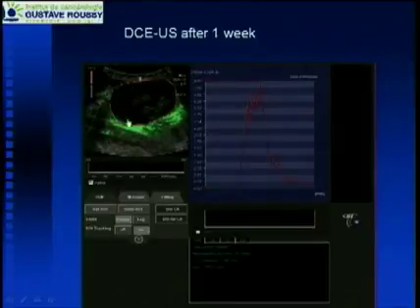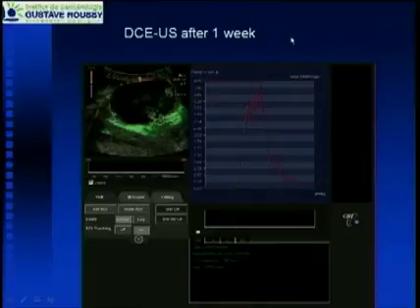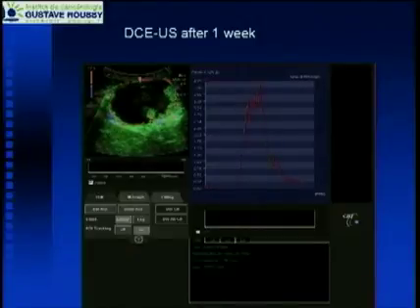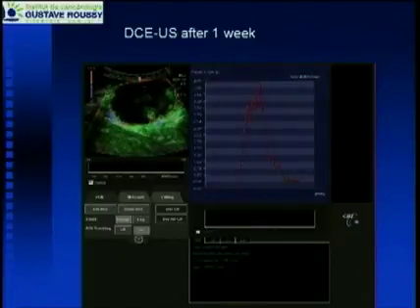So without contrast agent, it was impossible to understand the answer at the beginning of this evaluation. But when we inject the contrast agent, we have a dramatic decrease. It was an amazing answer. We never had this kind of answer in melanoma. And finally, the company decided to push now a lot of patients with melanoma. We don't understand the mechanism of this drug, but we understand probably for the melanoma it will be very nice.